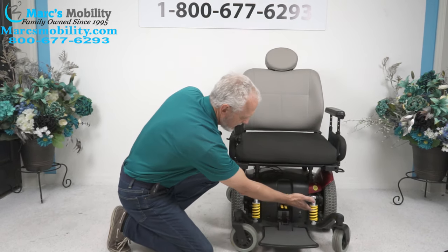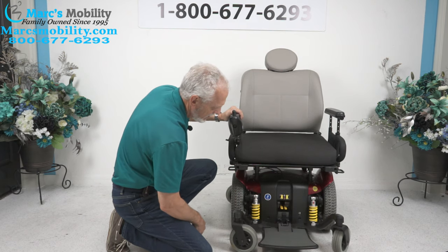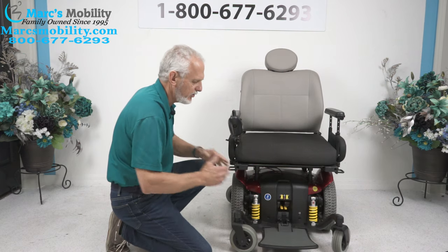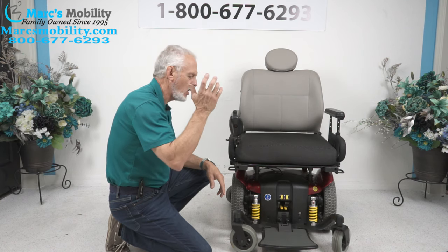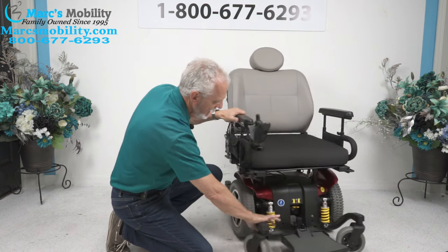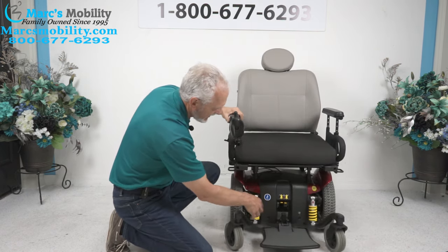You can see the suspension in the front — same thing on both sides. You have a motor for each wheel. If you want to push this chair manually — say something happened and you needed to put it in neutral — you turn the power off, lift these levers up, and the wheel is disengaged. You have to do both sides.